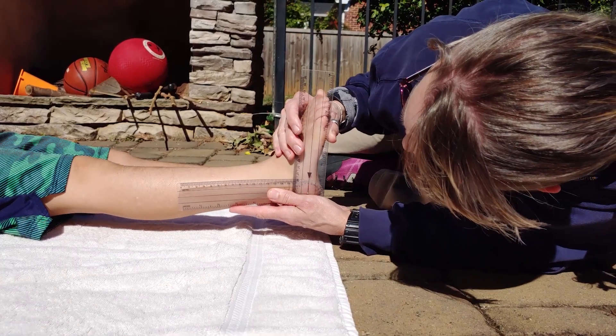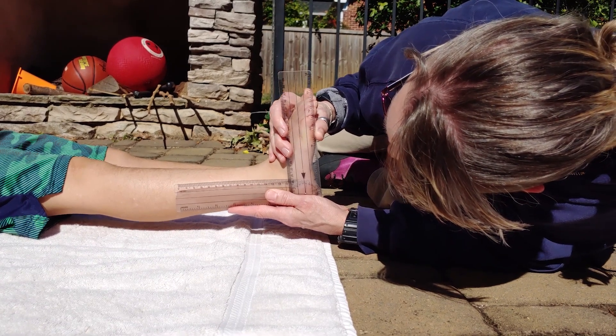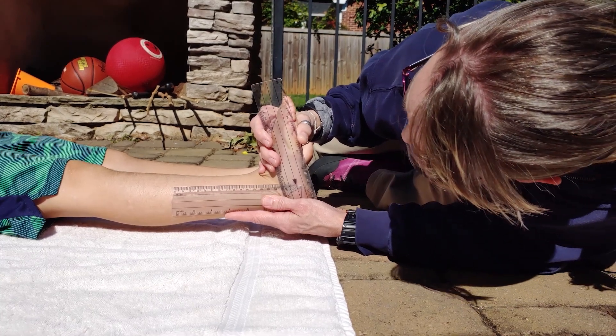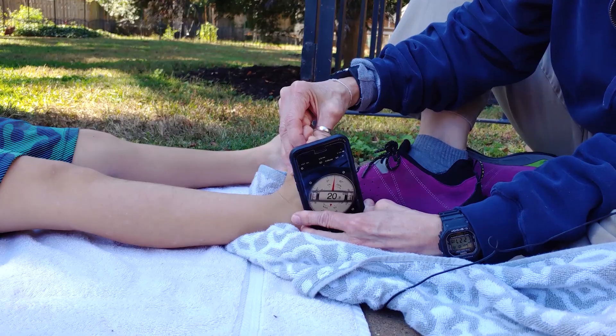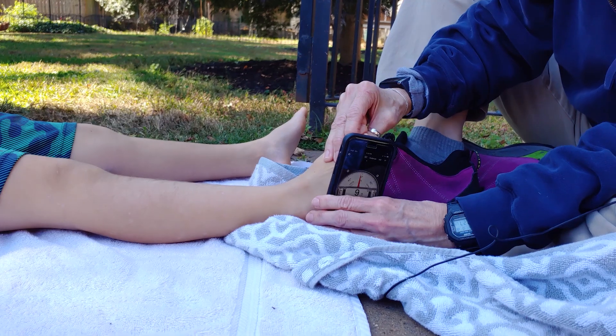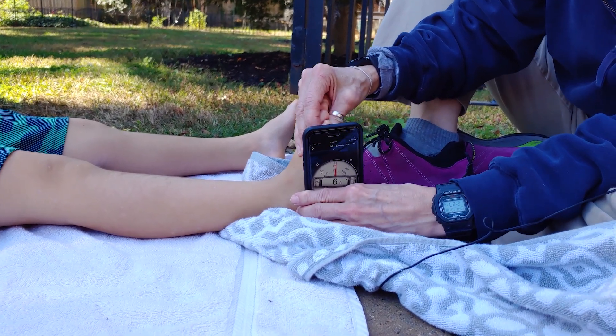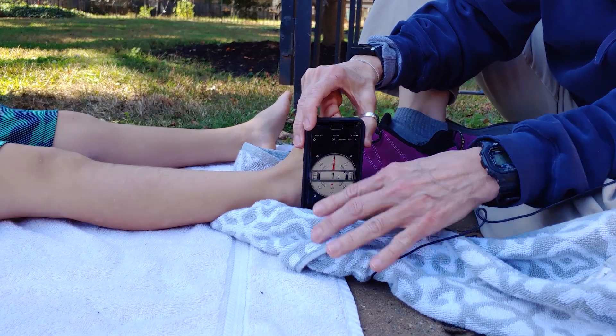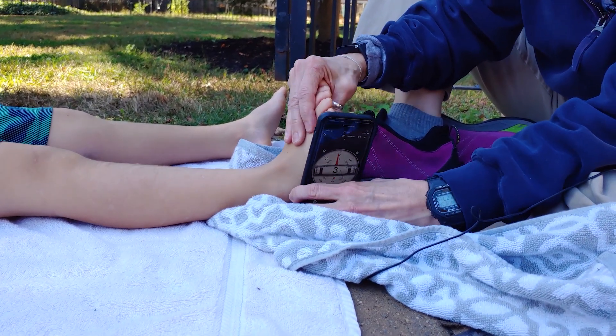I hope this was helpful so you could compare how I use the goniometer in the clinic and how you might be able to use the clinometer app on your phone to measure ankle range of motion. That way you can see at home if your child or you have ankle range of motion restrictions.